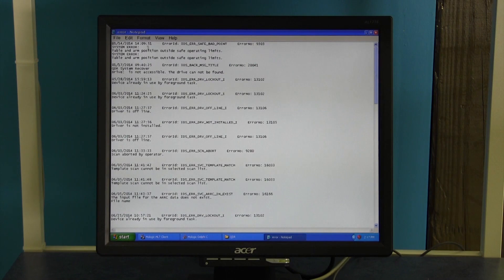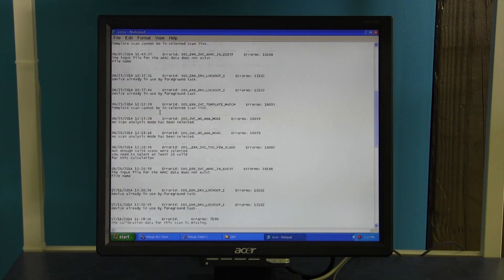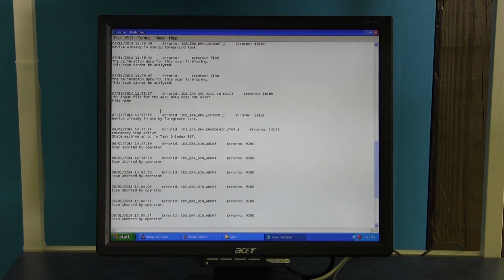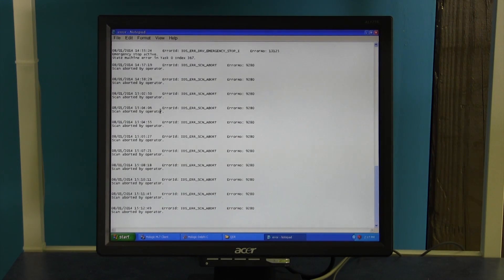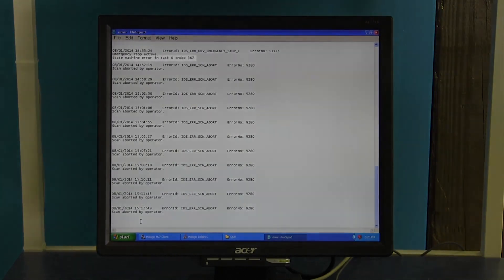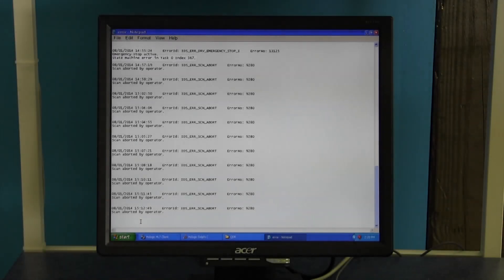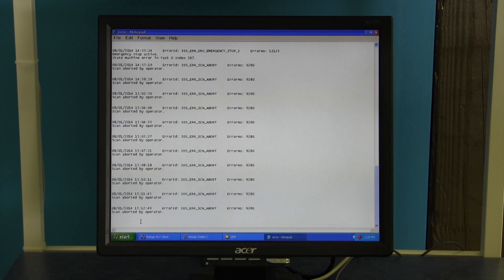Once you're into your error log, they're organized by date. Scroll down and find the most recent error codes. Once you've found the most recent error codes, read through the description and pass this information along to your customer service representative. This can help our engineers better diagnose your system.